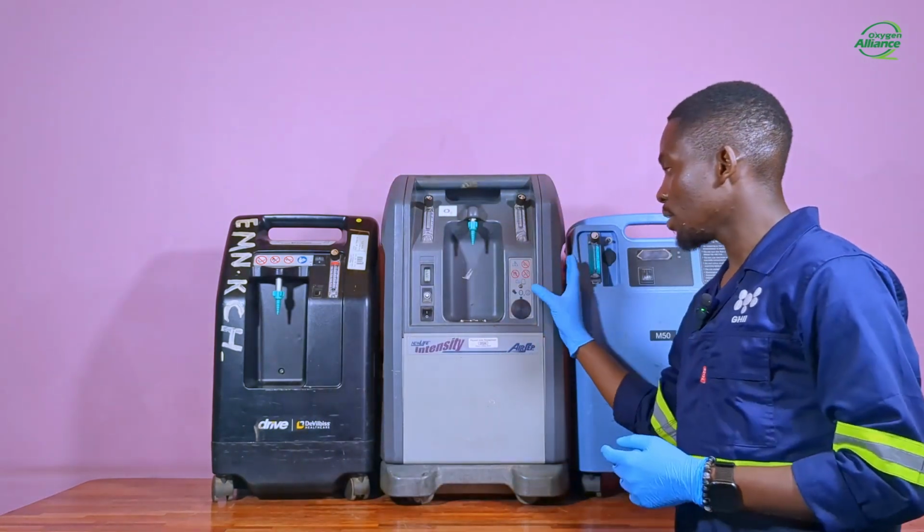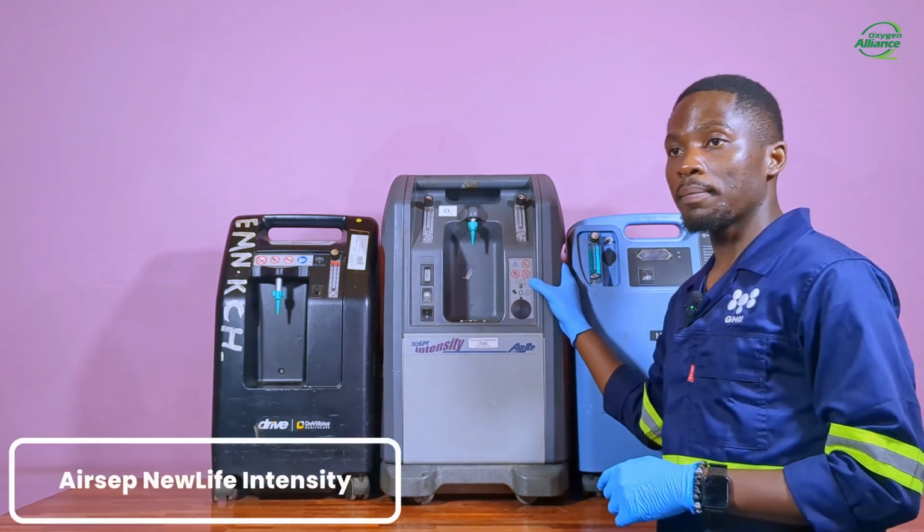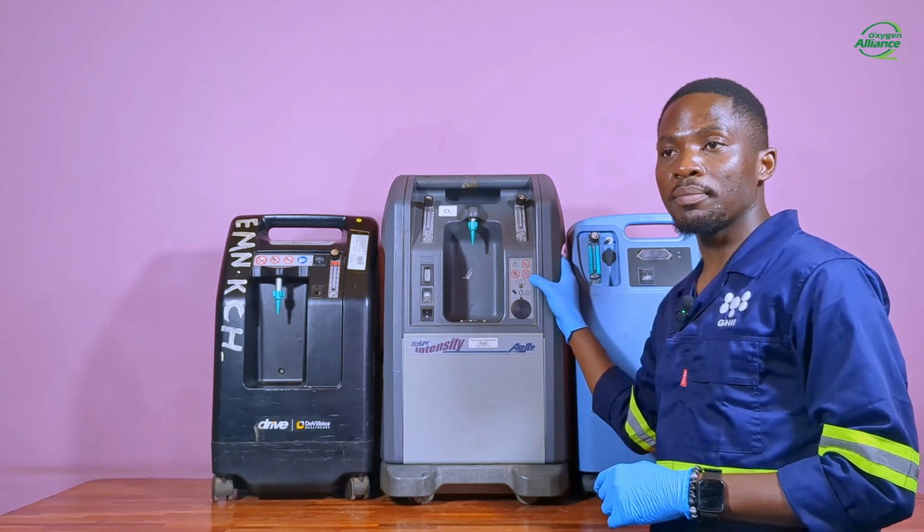Another cause of low oxygen purity in an oxygen concentrator is a faulty control board. This board controls how power and signals are distributed between the various components that are connected to it. These are the air compressor, the cooling fan, as well as the control valve. So I'll be using this model of an oxygen concentrator, the New Life Intensity AirSep concentrator, to demonstrate this problem.